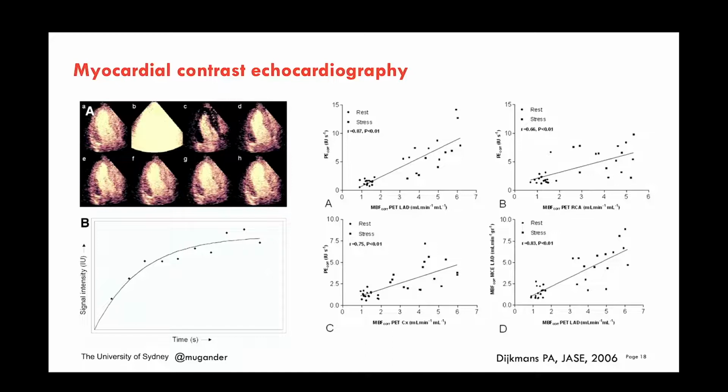And so you don't have the same post-processing rules or the same agreement with PET in different portions of the heart, which makes it a little bit more challenging to apply. And on top of that, there's a fair bit of variability in this. So when it comes to diagnostic precision, you want to know, it's all about the variability.